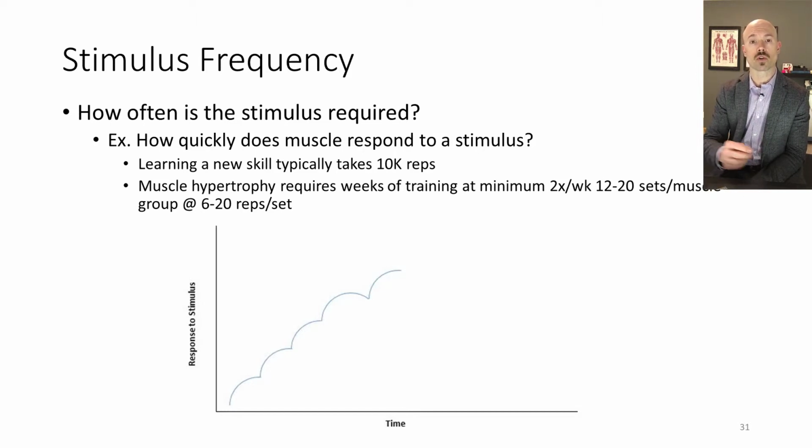So again, if we're trying to undo, let's say, a motor pattern, because they have been walking with an antalgic kind of gait, if we have the tape applied to the appropriate tissues and it decreases their perception of pain, it might be easier for them to regain a normal pattern because they're not experiencing that pain and discomfort as much. So that would be the benefit to using the tape over maybe some other modalities.